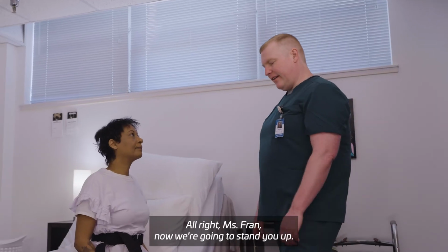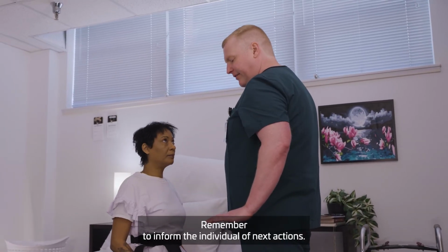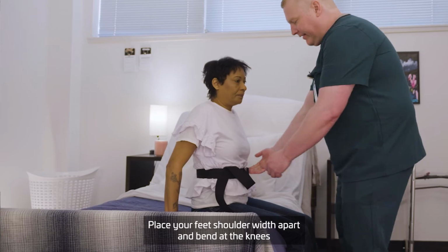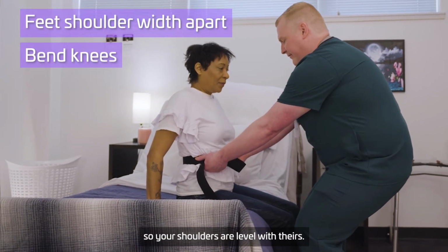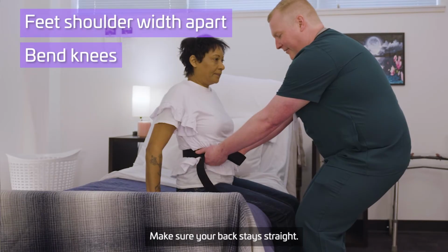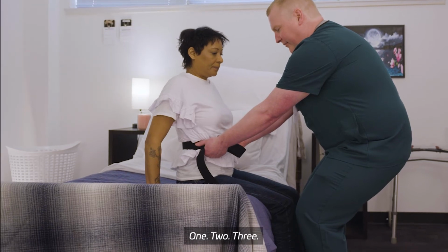All right, Miss Fran, now we're going to stand you up. Remember to inform the individual of next actions. Place your feet shoulder width apart and bend at the knees so your shoulders are level with theirs. Make sure your back stays straight. Steady your knees against theirs. 1, 2, 3.